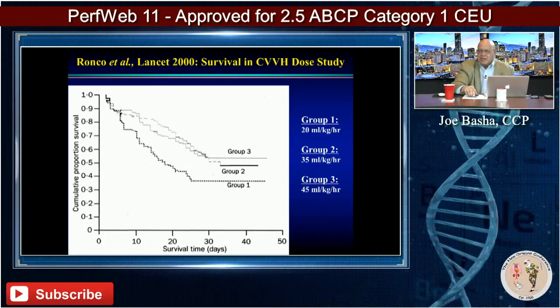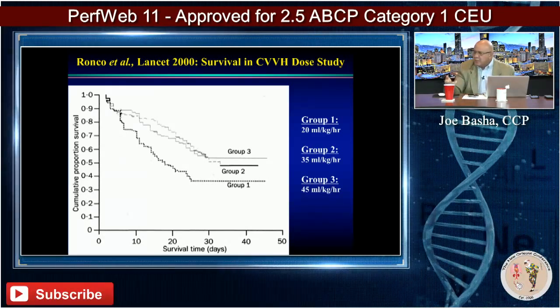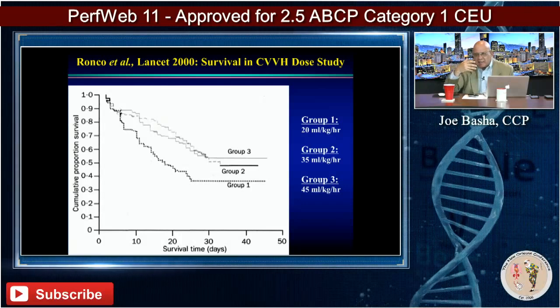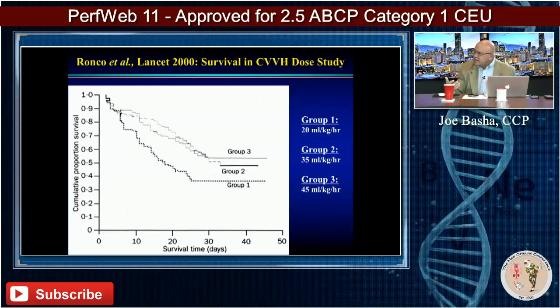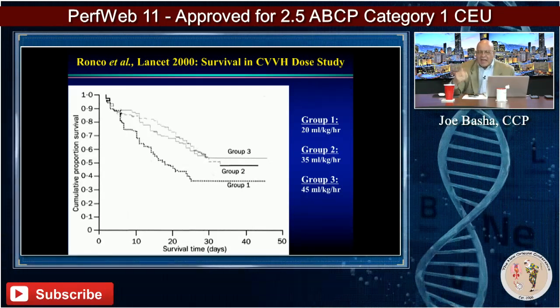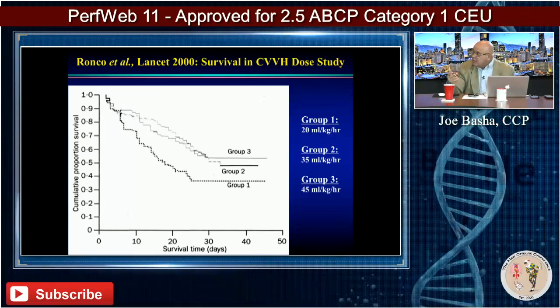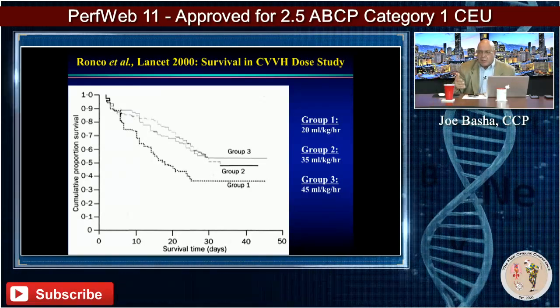And that's how much effluent is being removed. Now, you're replacing it with the replacement fluid, but it's just how they do it in the nephrology world. It's very different than us, but the dose is actually your effluent dose. That's what it's measuring.